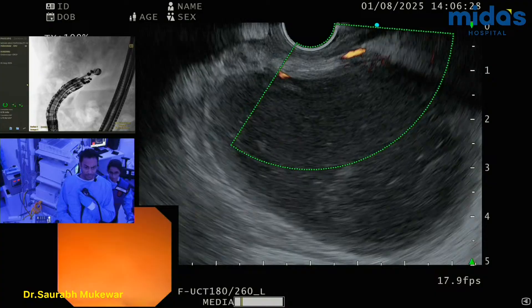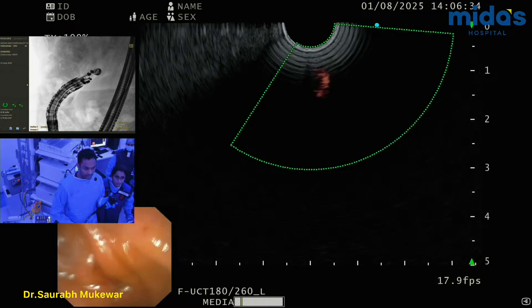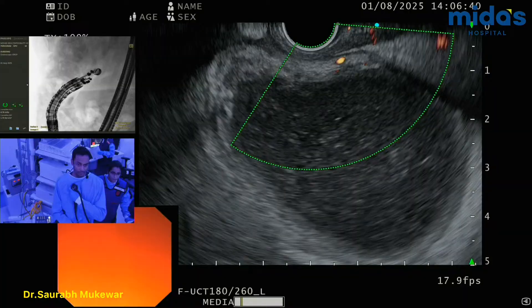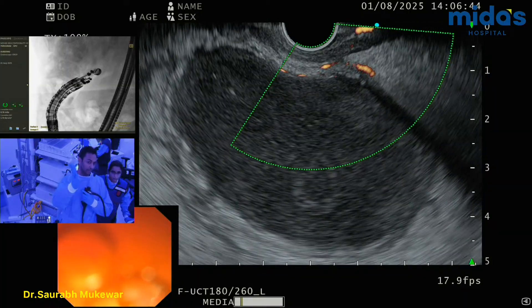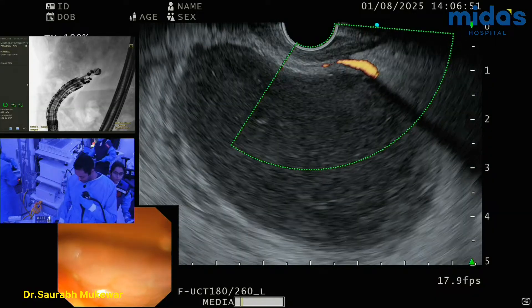Can I have a 10mm stent ready? And also, all of this goes a little out of the window once you get the stent in the scope, because with the stent the scope becomes very stiff. So let's see. We come here and then the stent is going to come at 7 or 8 o'clock-ish. Even if there's a vessel here, I'm okay. Let's see where the stent comes from.